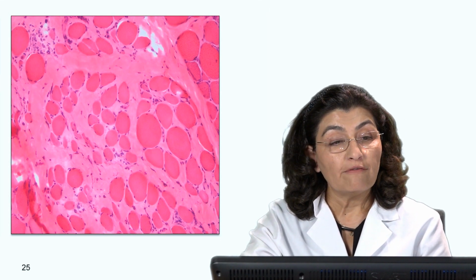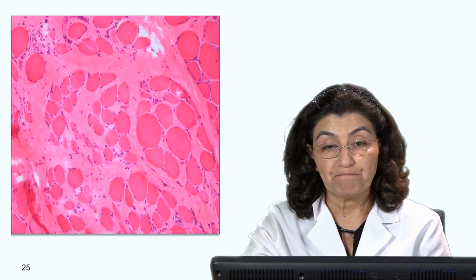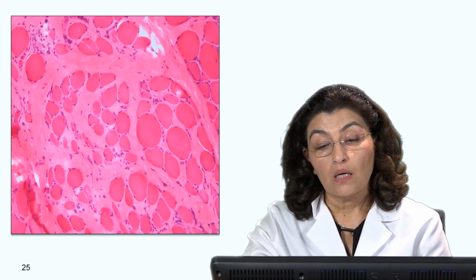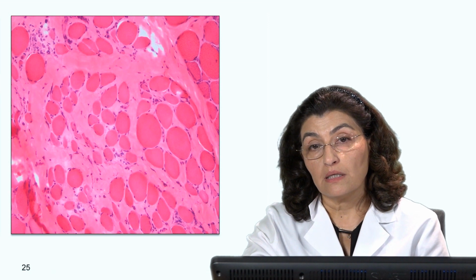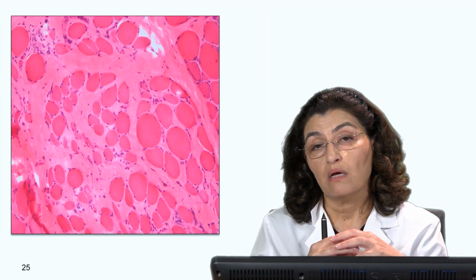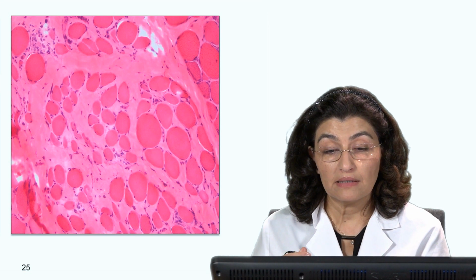Last, I would like to look at this muscle. This is a patient that is very weak and wheelchair bound. The muscle that is biopsied was clinically very, very damaged. You could see clinically that this muscle had no tone, was very small, very atrophic, basically melted down.